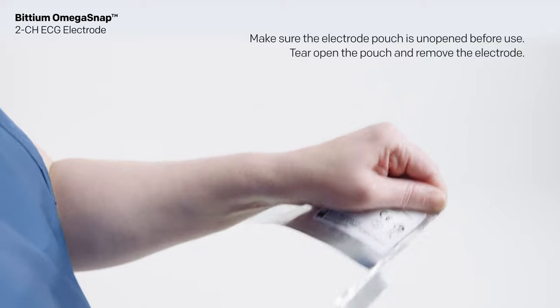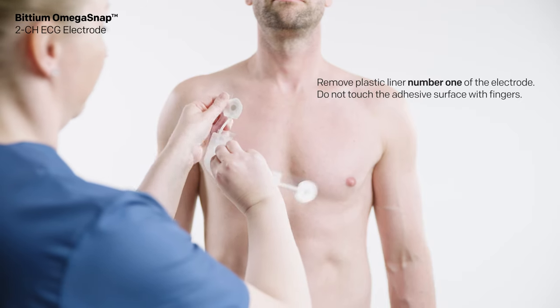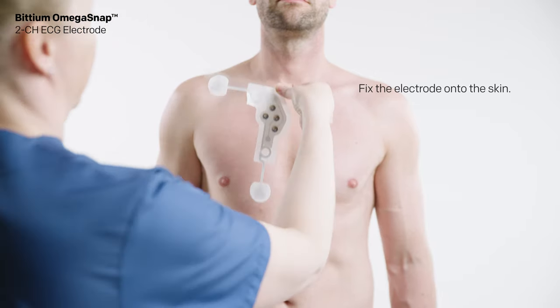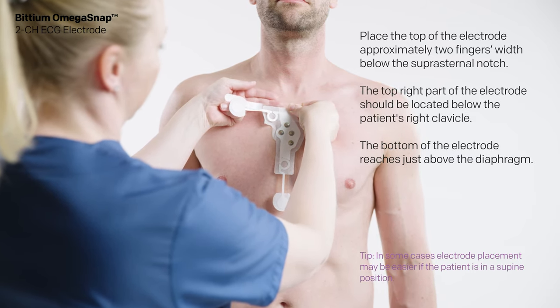Tear open the pouch and remove the electrode. Remove the plastic liner marked with number one from the electrode. Do not touch the adhesive surface with fingers. Fix the electrode onto the skin.